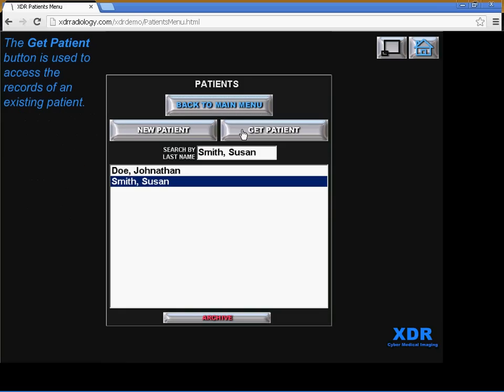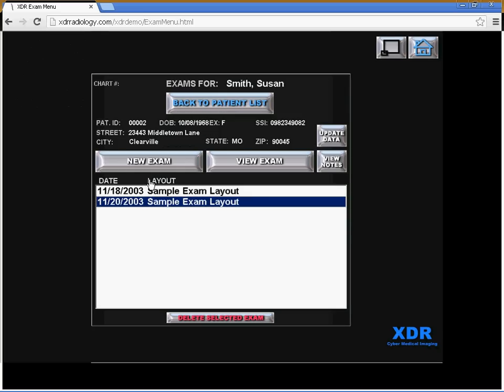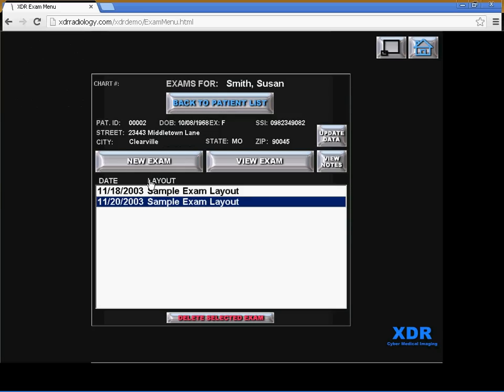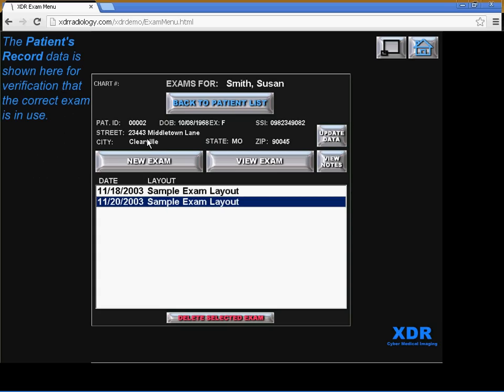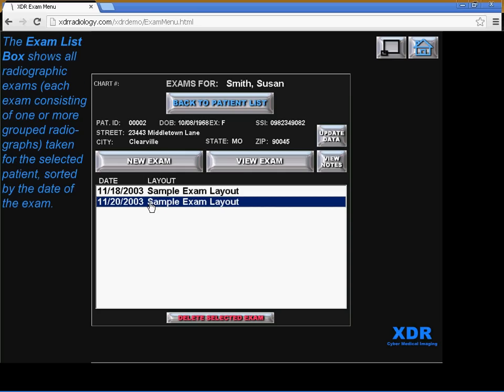Get Patient allows you to access the records of an existing patient. If we were to click on Susan Smith for example, you would see her patient record which would show her personal information on top for verification that the correct exam is in use for that particular exam.